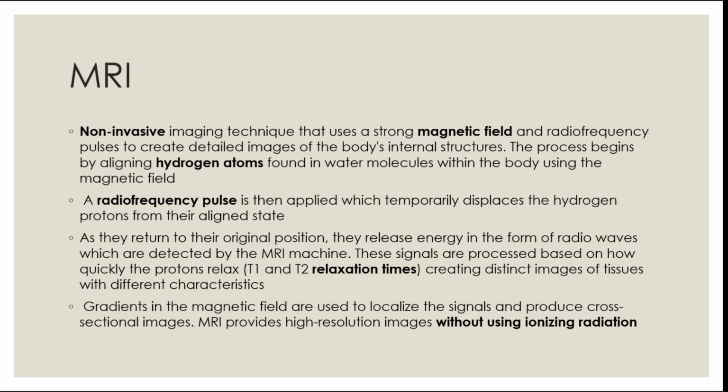The thing with MRI is that it's mostly never a first choice, because it's time consuming. You need at least 30 minutes to produce an image. It is expensive, and it's not very comfortable for the patient staying in the machine for a long time.